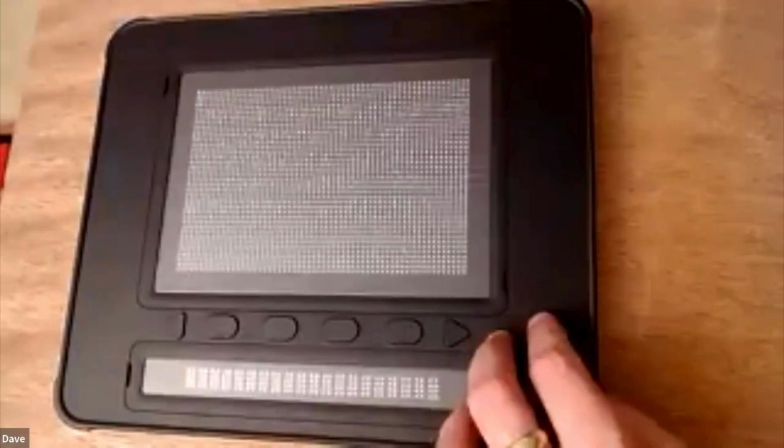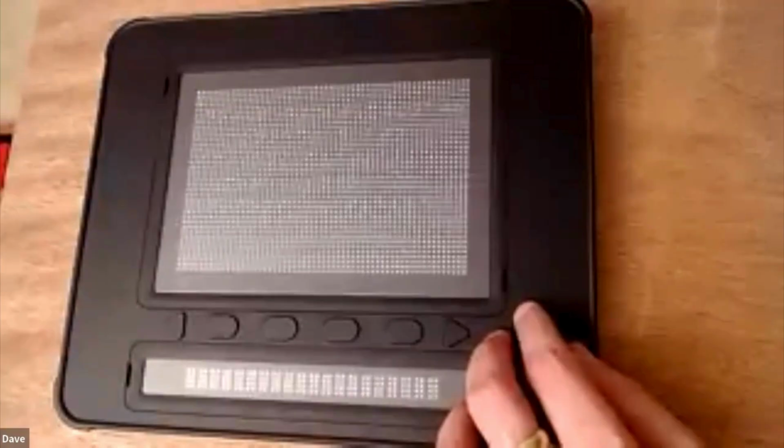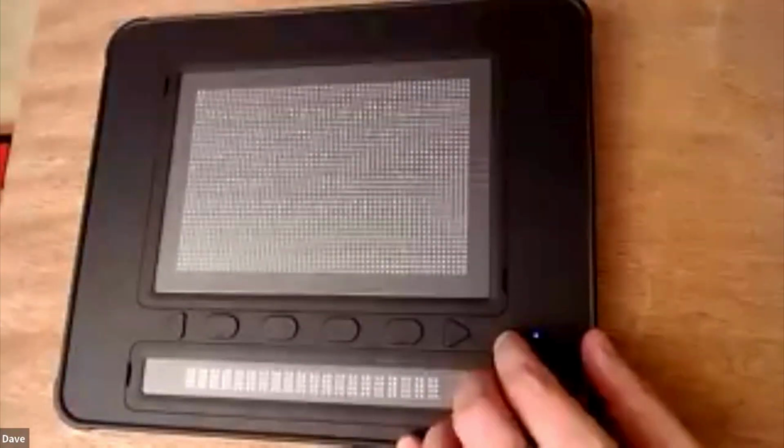The internal battery, from a completely flat battery, and I would recommend that you don't run it all the way down, but if you do, plugging it in for 2 or 3 hours usually brings the battery back up to a full charge.